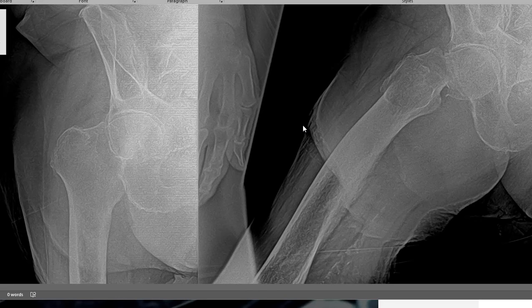When we're worried about a fracture on a hip, let's get an AP view of the pelvis and 2 views of the right hip whenever possible. I understand sometimes it's completely out of our control. We can't do anything with it, but that's what we have in an ideal situation. And then if we're not sure which hip it is, we may have to do an AP view of the pelvis and then look at 2 views of bilateral hips. So you end up with 5 images, but that's sometimes what we have to do if we're not sure.